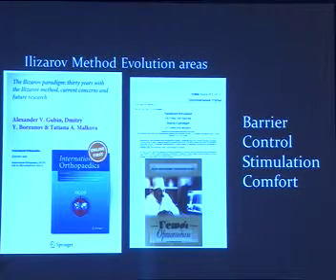Then stimulation, because we are speaking a lot about stimulation of bone, and you can use Ilizarov and different combinations of the Ilizarov method and other approaches to make stimulation. It's another big field of investigation and for improving our method. But what is very important? We must think about comfort. The system must be lighter and lighter, more comfortable for the patient.